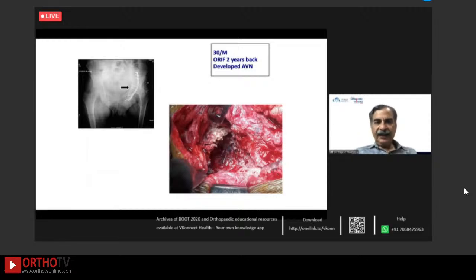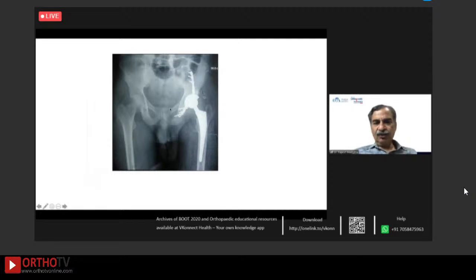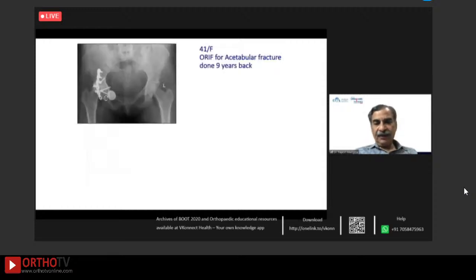A 30-year-old male had the ORIF 2 years back, developed avascular necrosis. You can see these two screws, which could actually be seen inside the acetabulum. And if you're prepared with the hardware removal set and retain the hardware which does not come your way, you can see those two screws have been removed, but everything else has been left because there's no point in unnecessarily complicating the surgery and increasing the duration of surgery with more blood loss as well as the risk of neurovascular injury. So this is the follow-up x-ray.